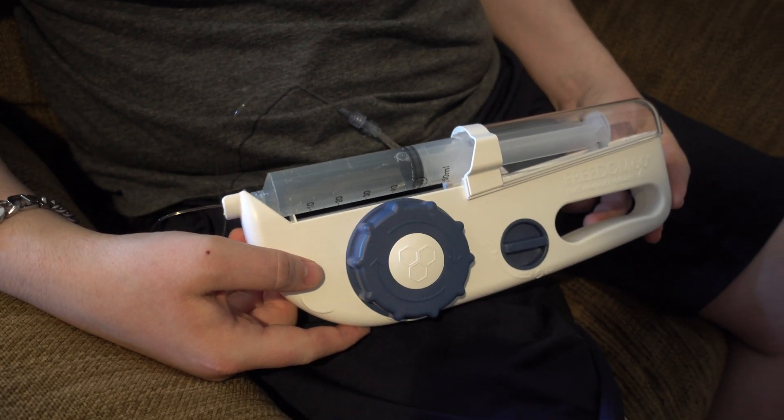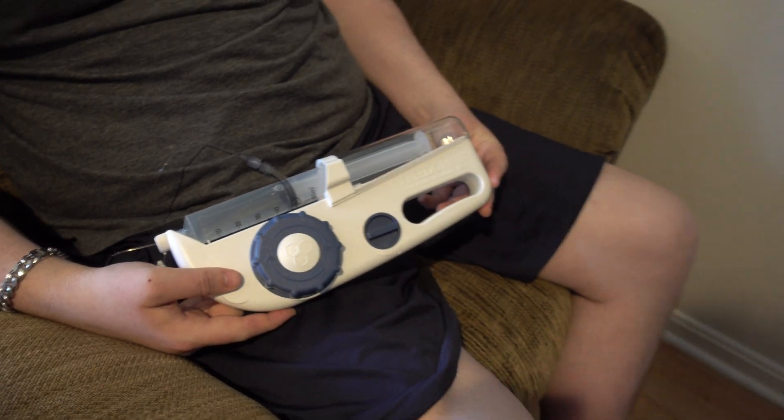And that's it — we started the infusion. It's 12:20 right now, so we'll mark that.